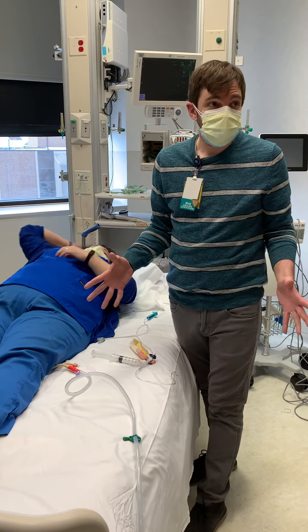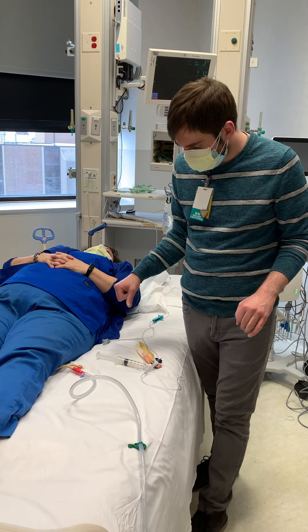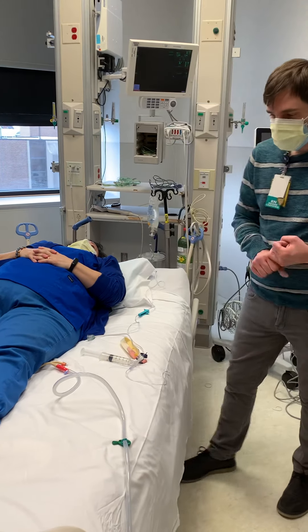First of all, you have to have a Foley. There's no way to do an intra-abdominal bladder pressure without being able to access the bladder. So step number one: Foley catheter is in.